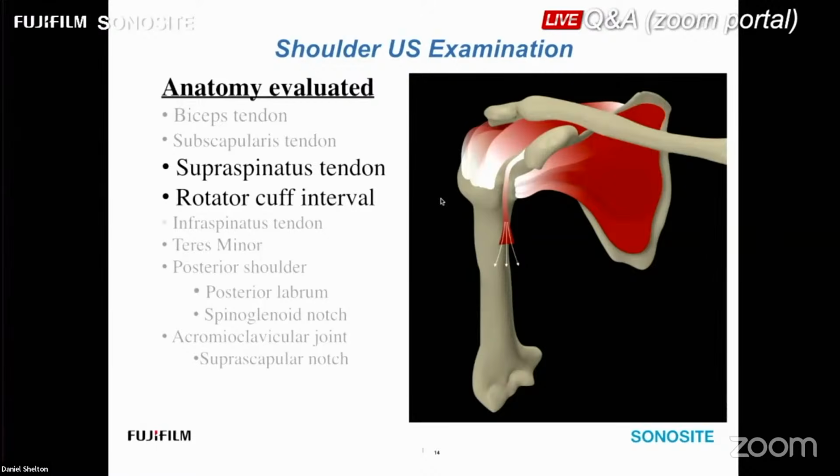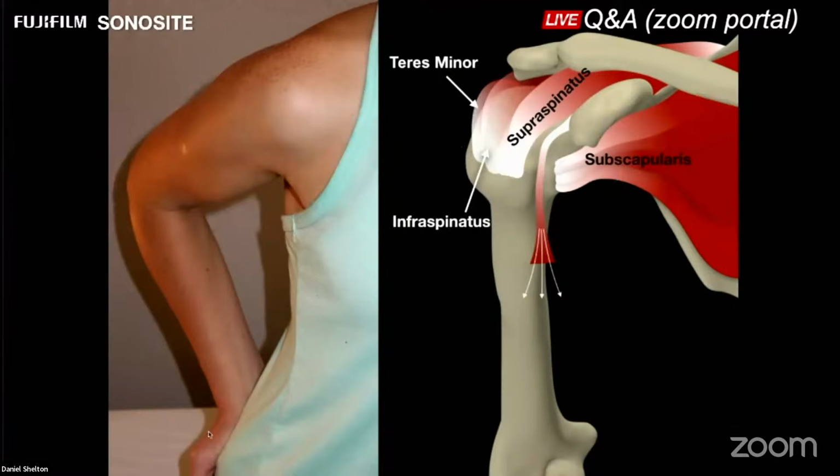So let's go ahead without any further ado, and you'll notice I have an anatomy image up here depicted already. This is the shoulder not in anatomical position. This is the modified Crass position, and it's very important to scanning the lateral shoulder. In the anatomical position, we're slightly externally rotated, and you'll see that the greater tuberosity would typically be sitting out here laterally underneath the acromion for the most part. So what we have to do to bring out these cuff structures like the supraspinatus and infraspinatus away from the acromion is we have to rotate the shoulder this way.